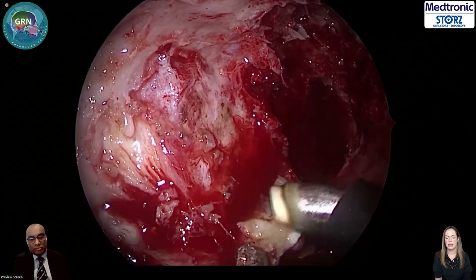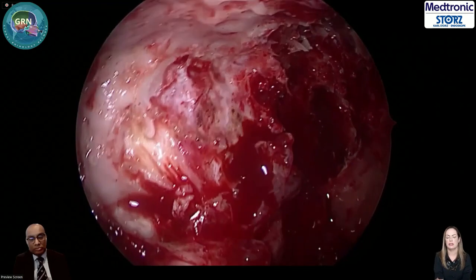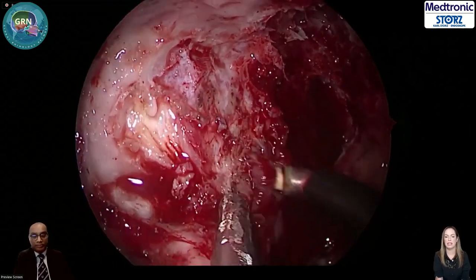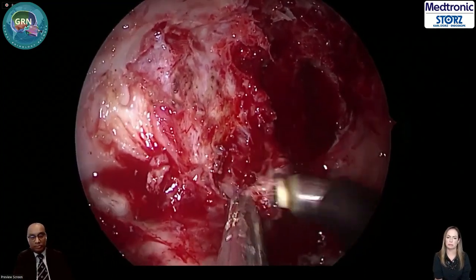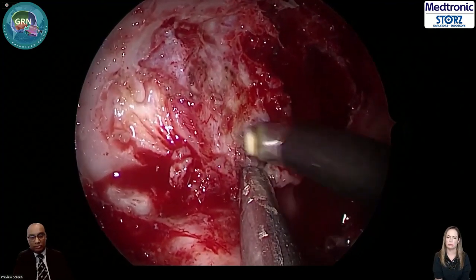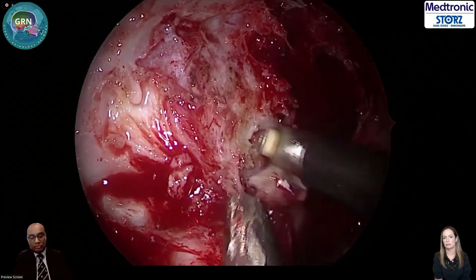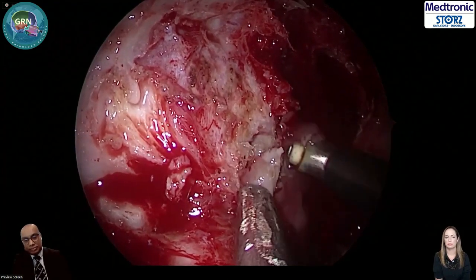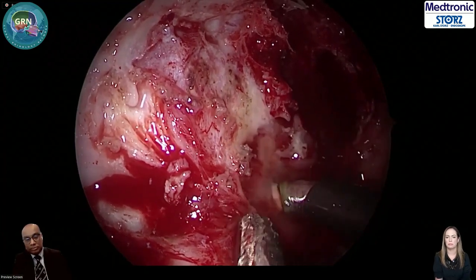And is that a special endoscopic tip for the coblator? So say you had the coblator for tonsillectomy, for example, in your department, is it easy enough to get the endoscopic end? There's a special endoscopic tip for the coblator. Yeah, we have the Precise Max, but I use the EVAC 70. I don't use the Precise Max actually. Precise Max is good, but it's quite expensive in India.